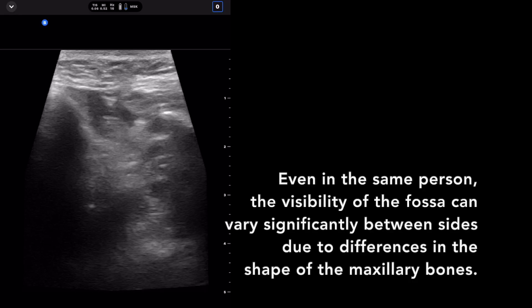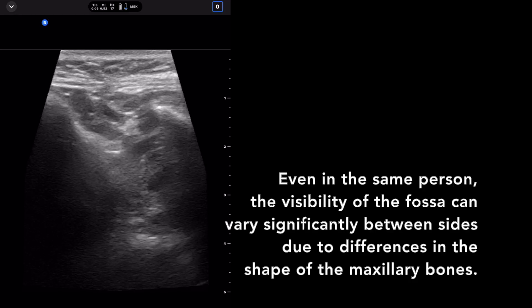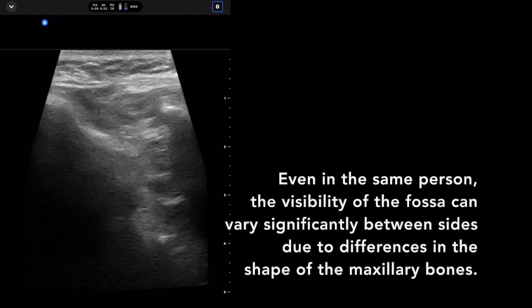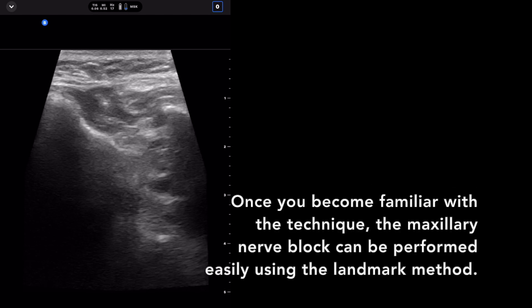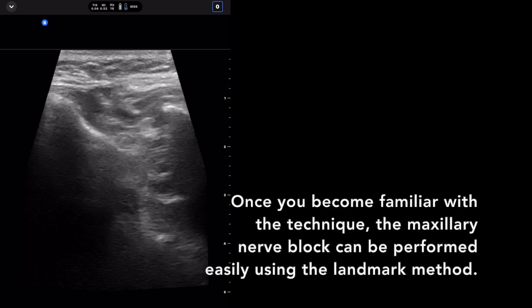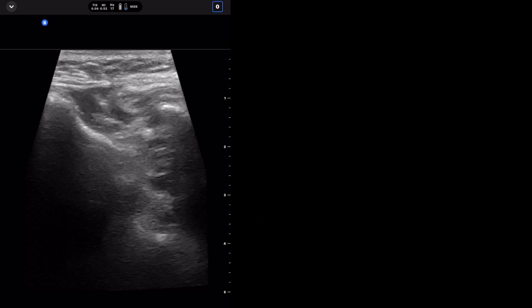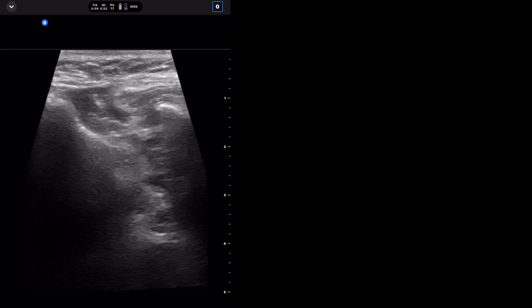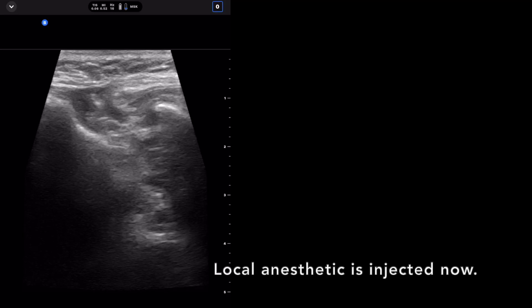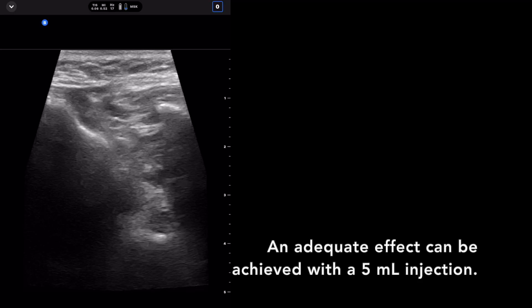Let's watch the block on the opposite side in real time. Even in the same person, the visibility of the fossa can vary significantly between the left and right sides due to differences in the shape of the maxillary bones. Once you become familiar with the technique, the maxillary nerve block can be performed easily using the landmark method. Local anesthetic is injected — an adequate effect can be achieved with a five milliliter injection.